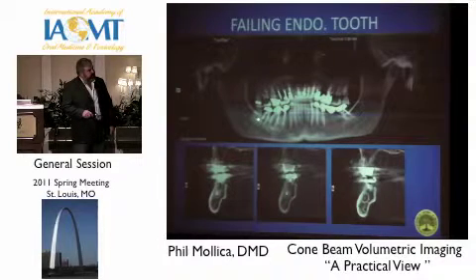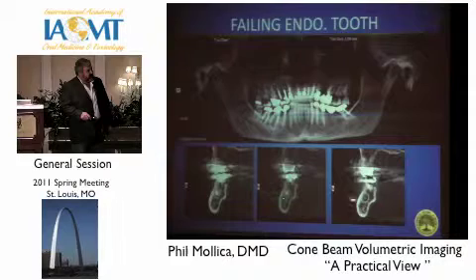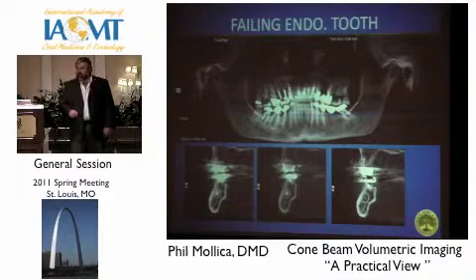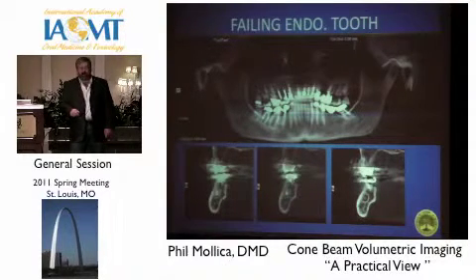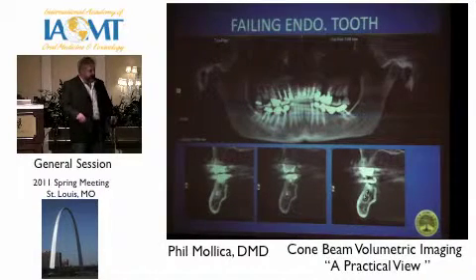How do we see this? We look here. Well, that doesn't look too bad. Maybe a little ratty, but look at this. Those infections around the root canal itself. They give you a sense of that. So whatever form of treatment you do, at least you know what you're dealing with.